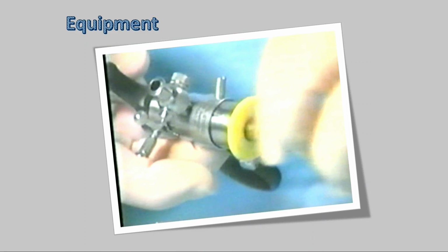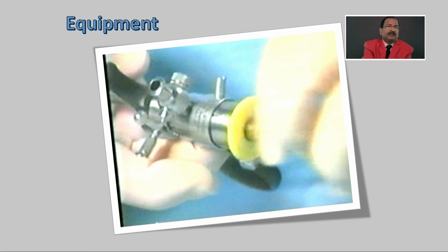It should not be loose, because if it is leaking, then you will not get sufficient pressure, and then the uterus will not distend. One of the biggest problems of beginners is not getting the distension, because either they overdilate or their cannula is loose.